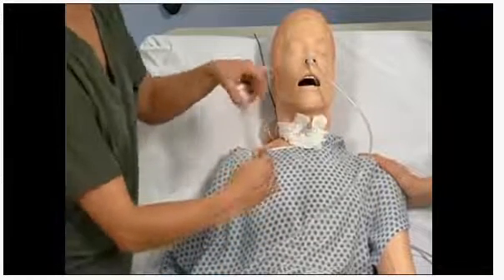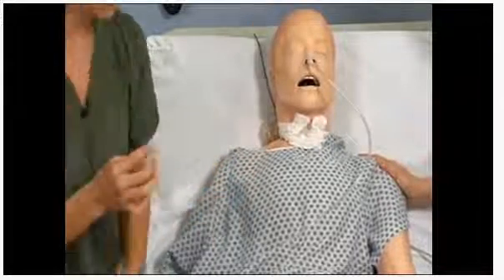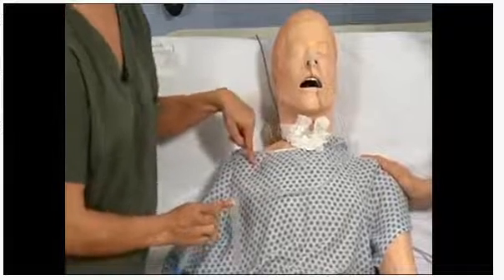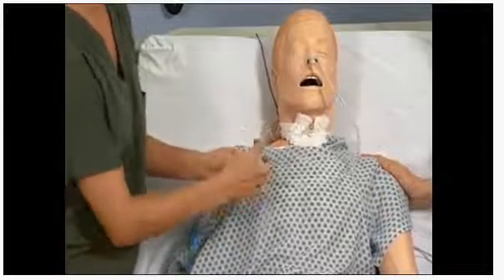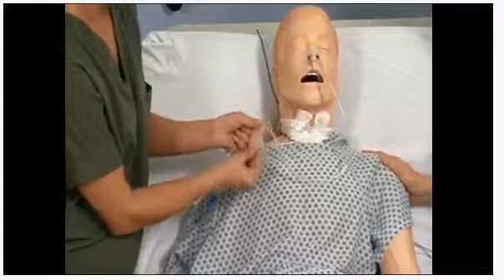Get a piece of tape. You want to make sure that you get enough leeway so your patient can turn their head side to side and not pull on it. Because you definitely don't want to have to do this again. And what I'm going to do is get my piece of tape and then I'm going to put them together.